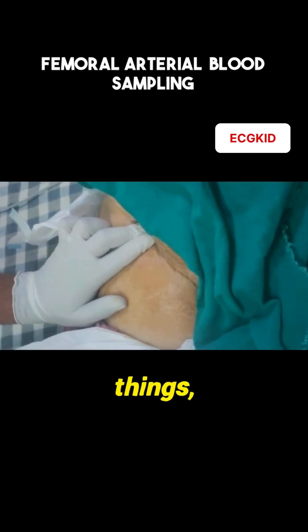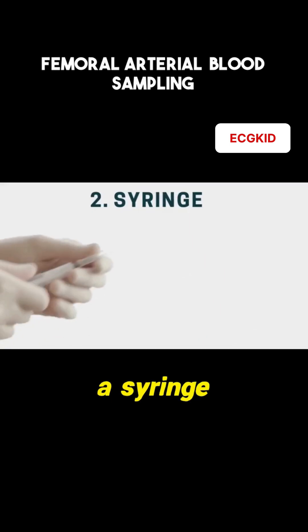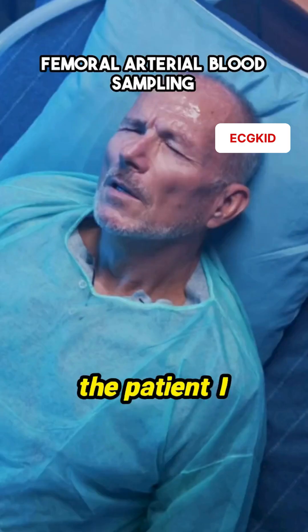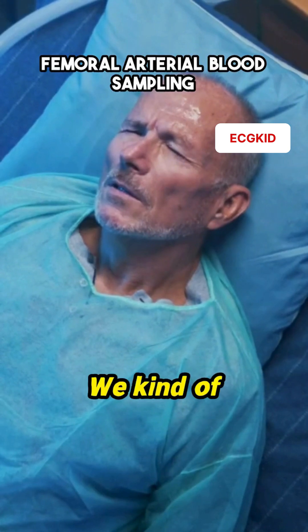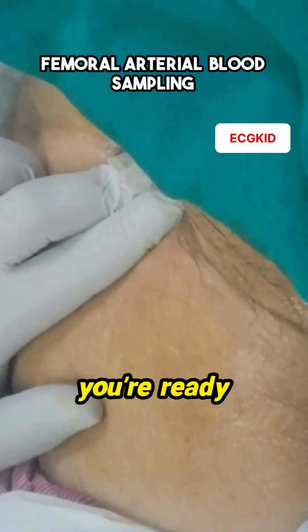For this, you'll need just three things. Gloves — obviously, you don't want to touch that part without gloves. A syringe, because how else are we going to draw blood? And the patient — I mean, come on, we kind of need them for this procedure to happen. And that's it. Once you've got these, you're ready to go.